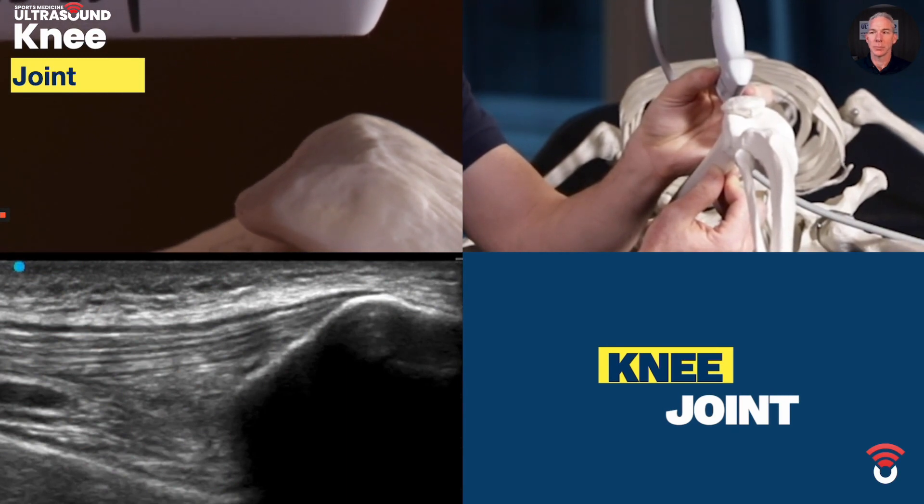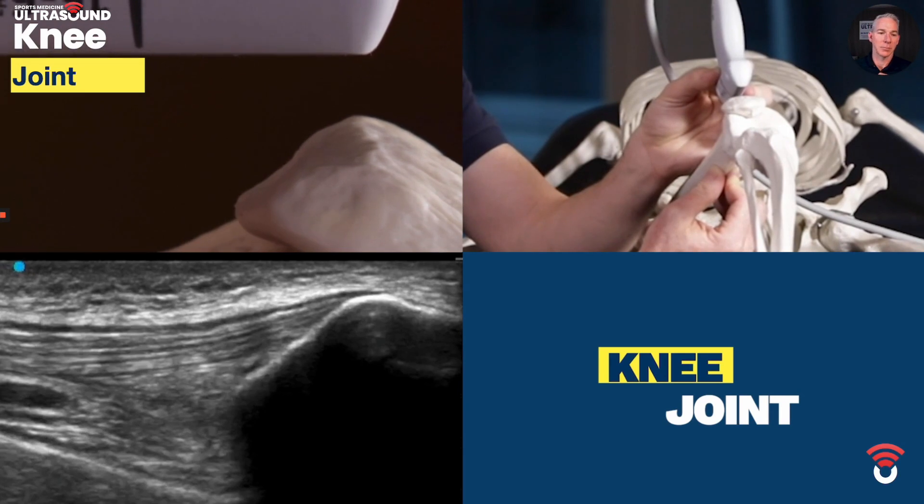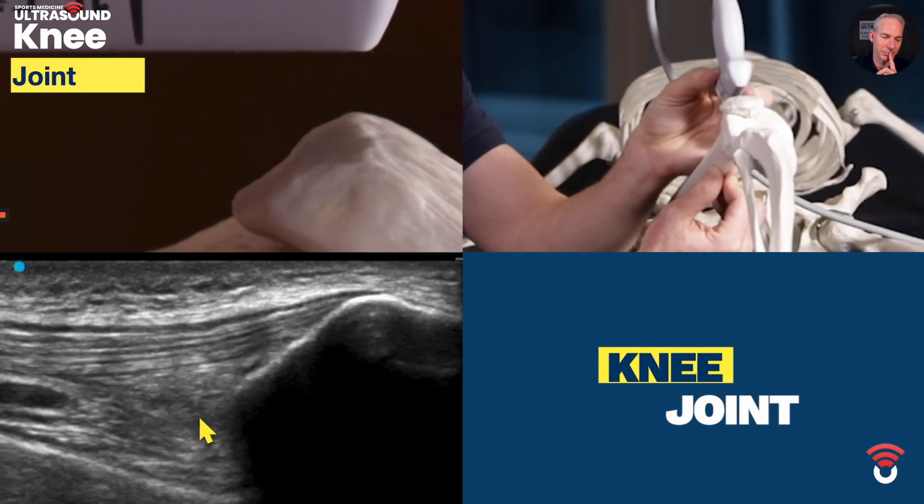The area of interest is going to be the hypoechoic or very dark area between the two fat pads that will show on the screen shortly. That's how we scan for the suprapatellar recess of the knee joint, which is how you get an injection into the knee joint fluid.